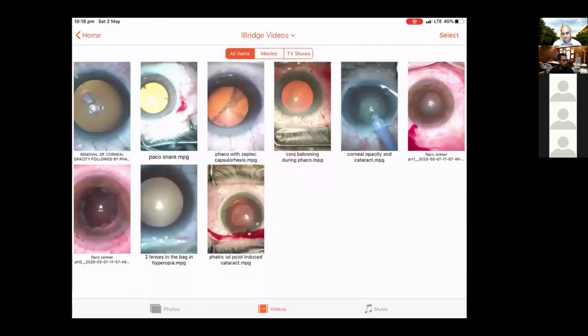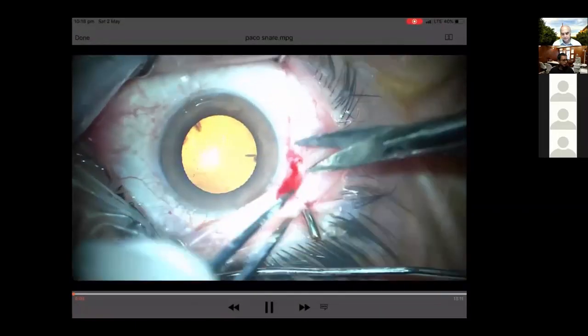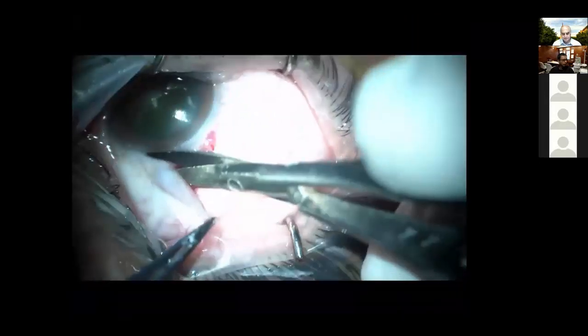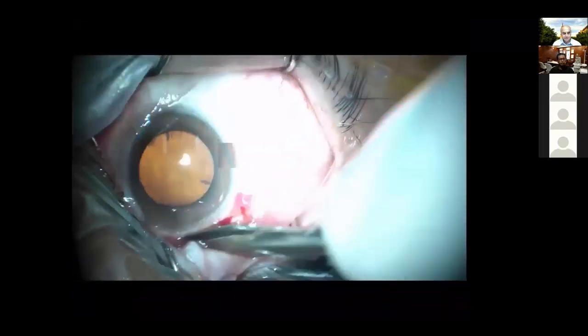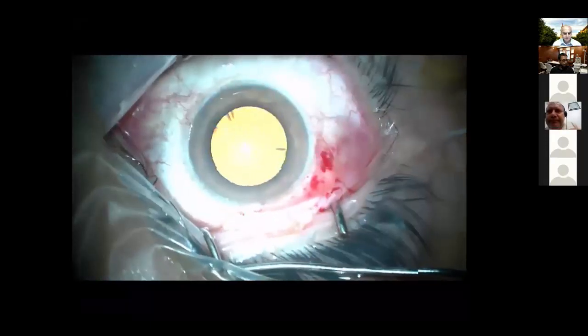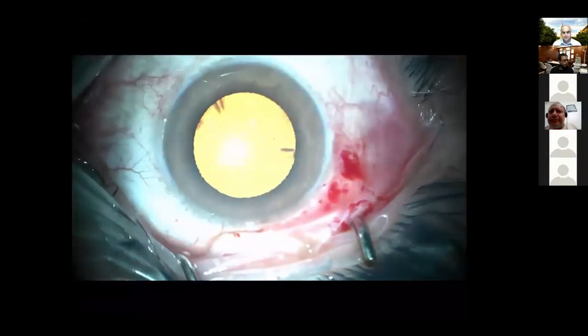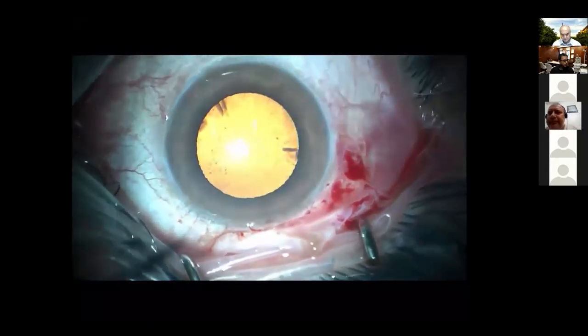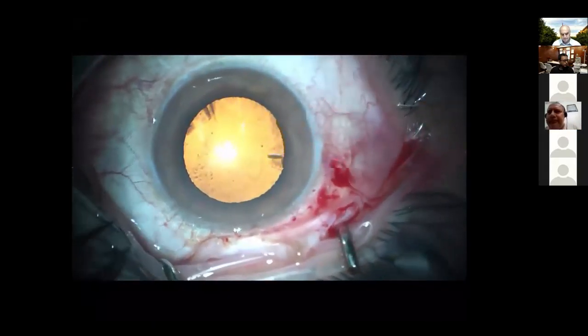Okay. My next case, I'm going to show an interesting video on phaco snare. This is an alternative technique in order to remove the cataractous lens through a sutureless incision without the use of phacoemulsification. And actually this snare, I think it was first introduced in India, and we adopted this technique in some of our cases.